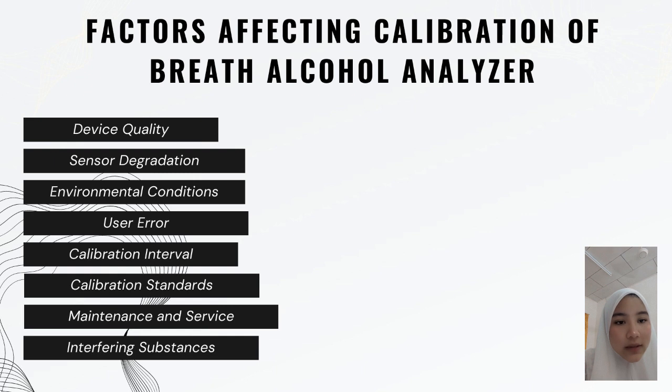Third is environmental conditions. The operating environment can impact the calibration of a breath alcohol analyzer. Extreme temperature, humidity, and exposure to substances like cleaning agents or solvents can affect the device's performance and calibration accuracy.